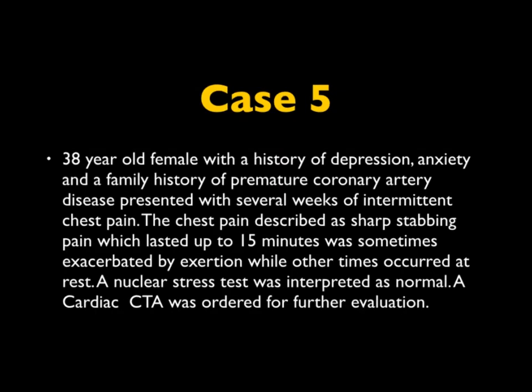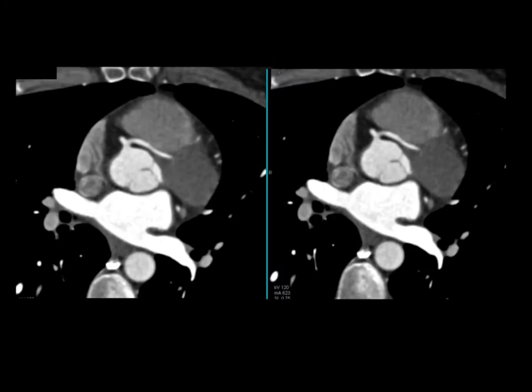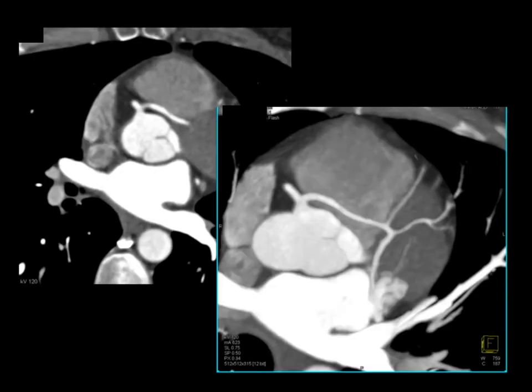Let's look at another case. The patient has a complex history of depression and anxiety, had chest pain, stress test was negative, and the patient was insistent on a coronary CTA, which was obtained. Looking at the images, you see the patient's right coronary, and now you see it bifurcating into two vessels. Looking more closely, what you really see is that the patient's left main coronary artery is coming off the right coronary, just beyond its origin.